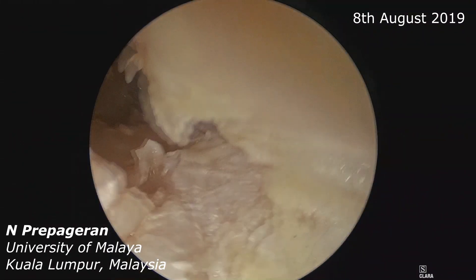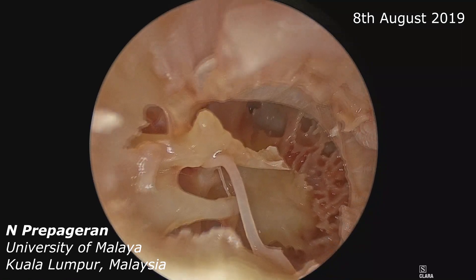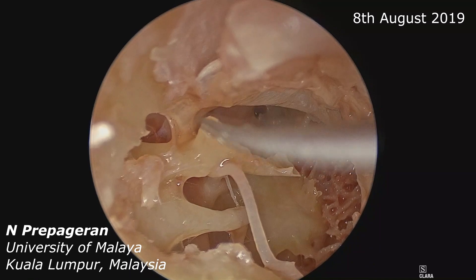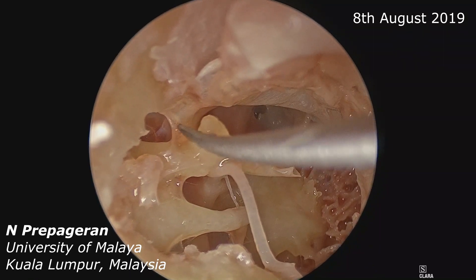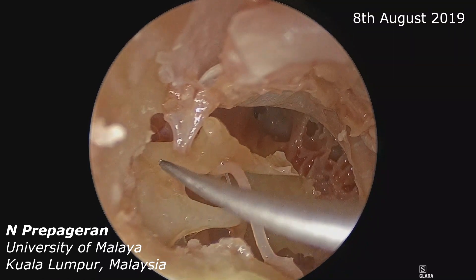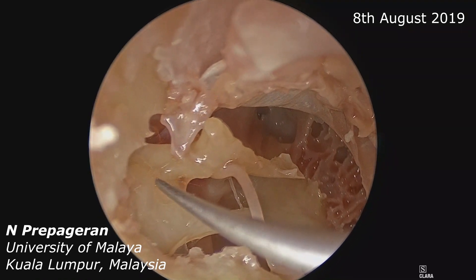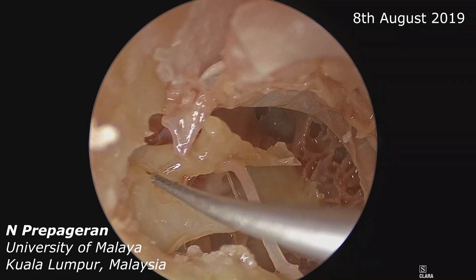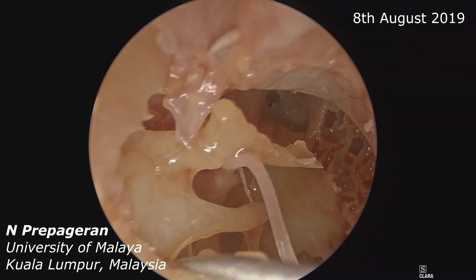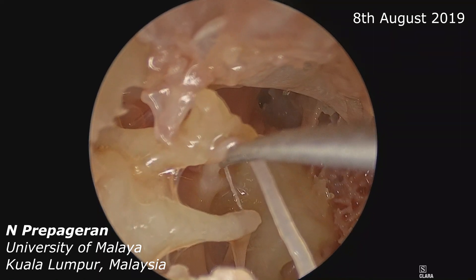Now we are able to visualize the head of the malleus. This is the malleus neck. That is the anterior mallear fold. This is the head and neck of the malleus — I can see the head of the malleus coming into view. This is the malleolar incudal joint — can you see the joint? That's the body of the incus. The short process would be here. We have preserved the entire ossicle — that is the processus cochleariformis.